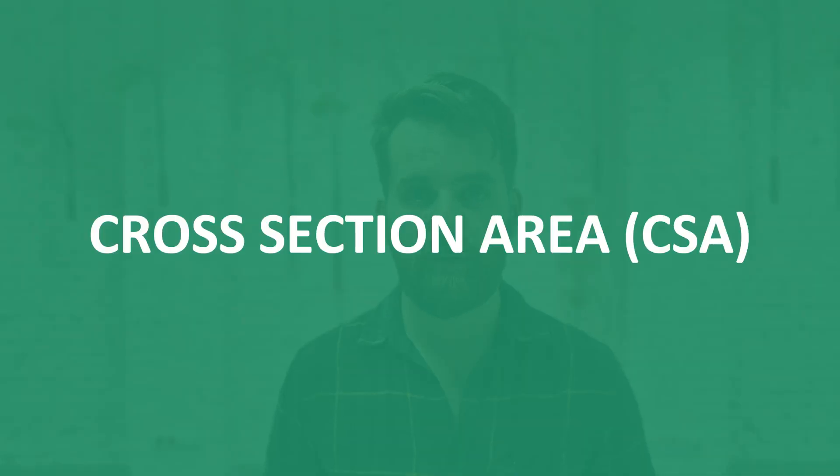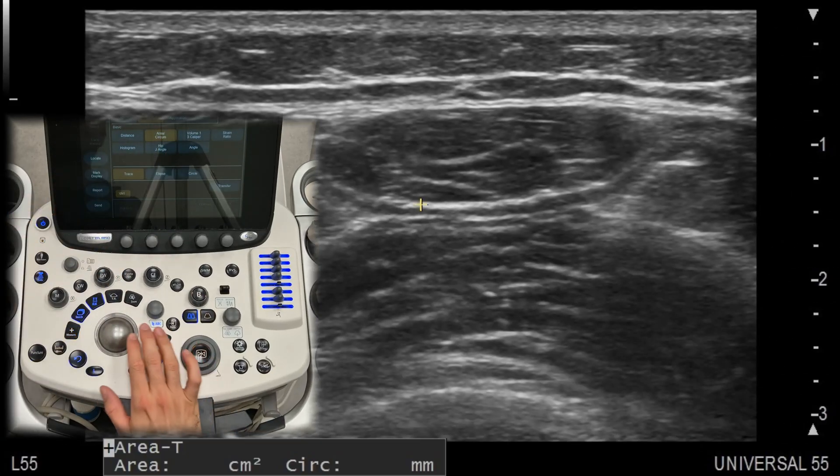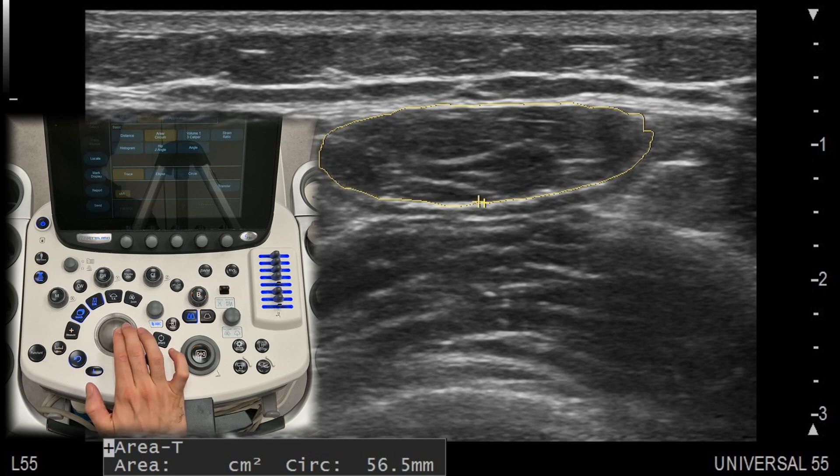Cross-section area is key for evaluating muscle size, tendons, and certain lesions. Most machines allow you to trace around the structure of interest to automatically calculate the area. This is particularly useful when assessing nerve entrapments or monitoring muscle atrophy or hypertrophy in patients.